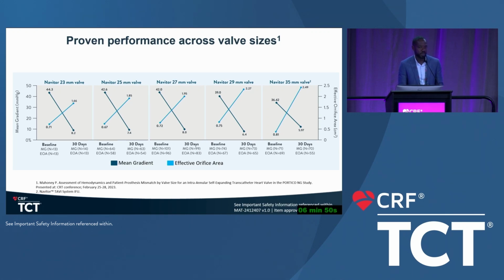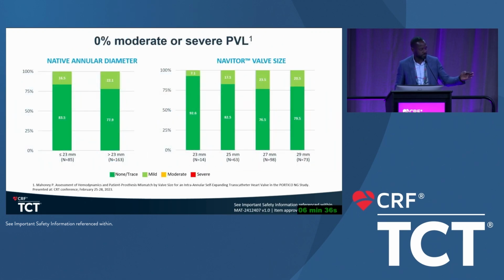There is one last thing that I would like to discuss with you guys, maybe briefly: what is an acceptable PV rate in 2024? Maybe Adnan, what do you accept? I'm sorry, the what rate? Paravalvular. Oh, PVL rate? Yeah. That's a great question.